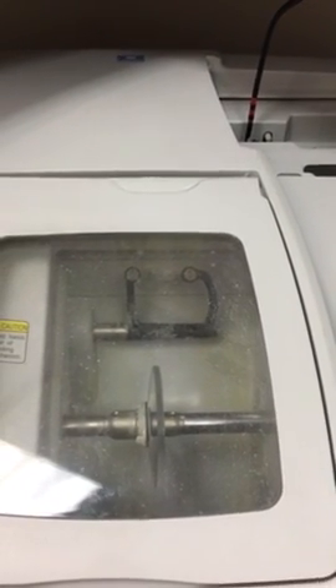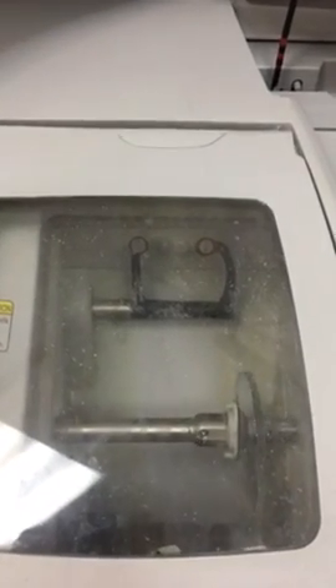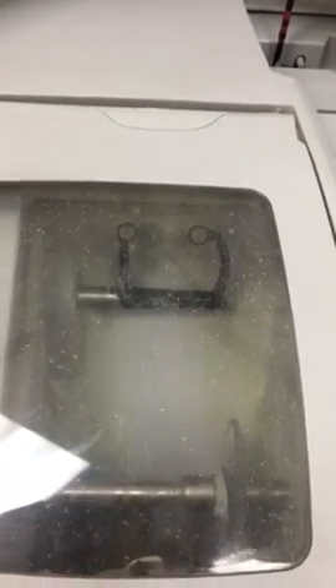So it's cutting the pattern of the frame right now, and then it's going to cut the lens. How long did that take, Rachel? It probably takes about 15 minutes, and that time is going to vary, so it's going to take a little longer. Right now we're edging polycarbonate, which is probably our most used material.